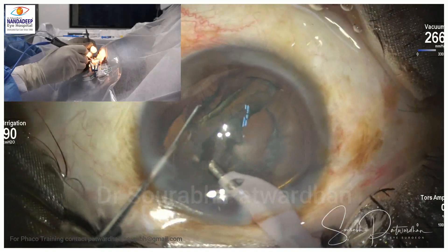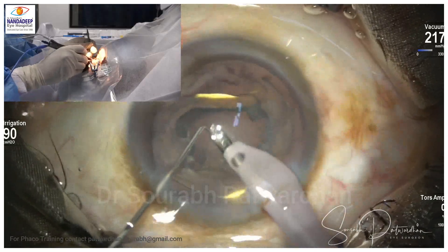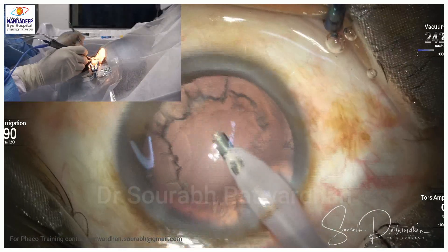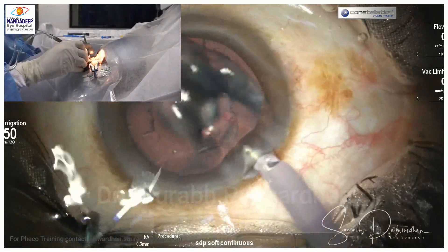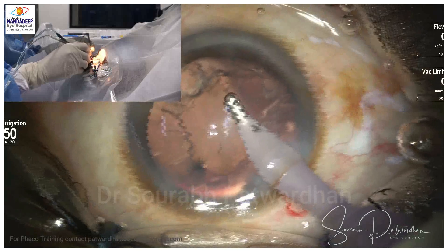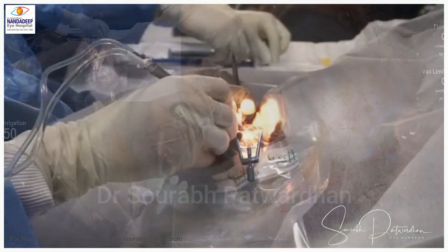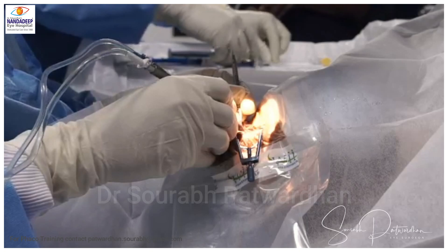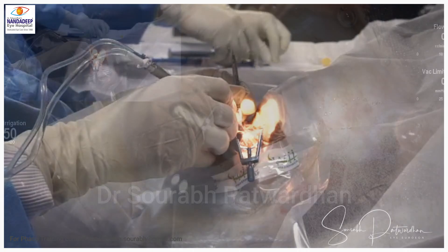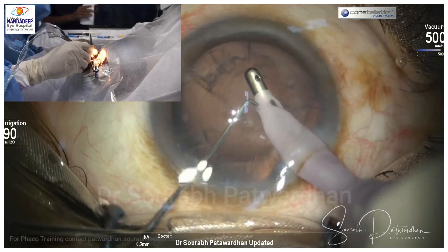During phaco, just watch how the hands are properly rested over the patient's forehead. If you are doing temporal approach, your hand must rest on the forehead or the cheek of the patient so that you have proper stability. Many times surgeons hold the probe too far away and the fingers cannot reach the patient's face or forehead, so you must make sure your hands are properly resting.